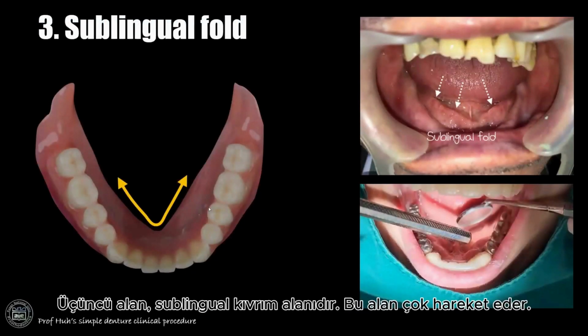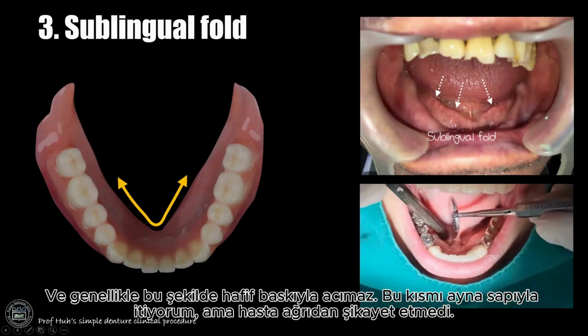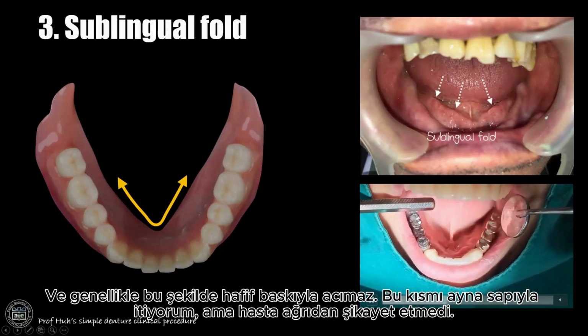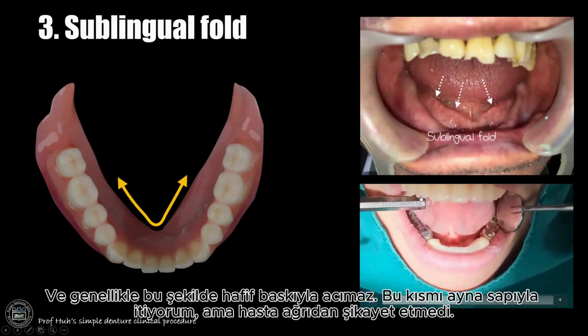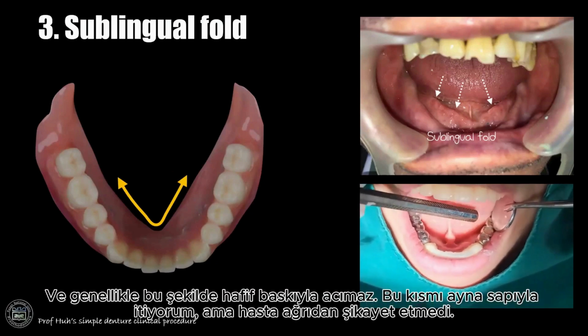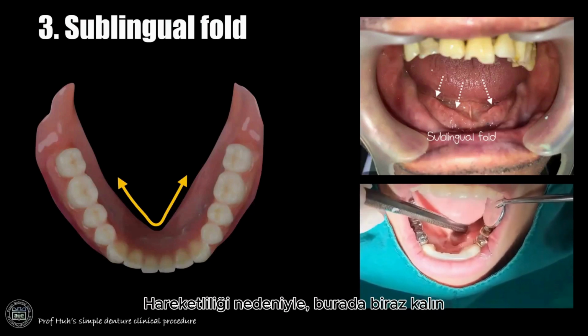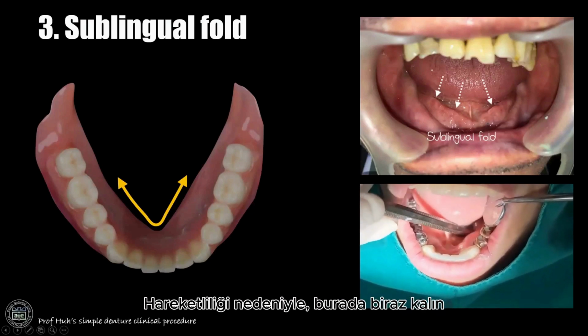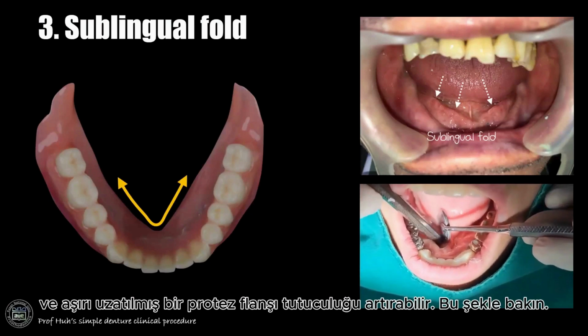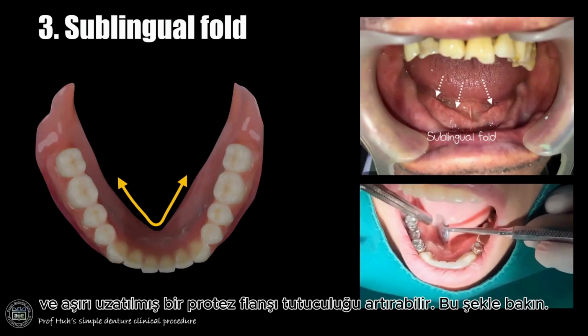Okay, the third area is the sublingual fold area. This area moves a lot and usually doesn't hurt with light pressure like this. So I pushed this part using the mirror handle, but the patient didn't complain about pain. Because of its mobility, a slightly thick and overextended denture flange here can improve retention.